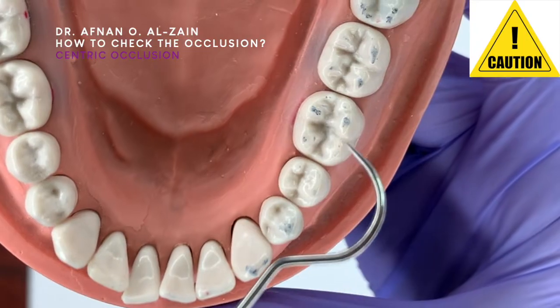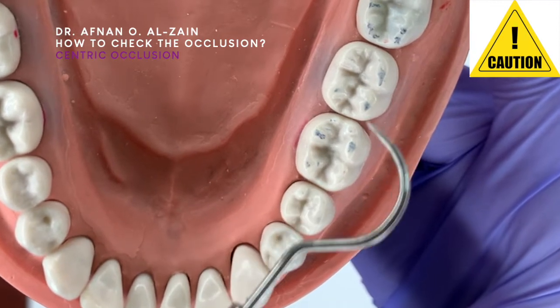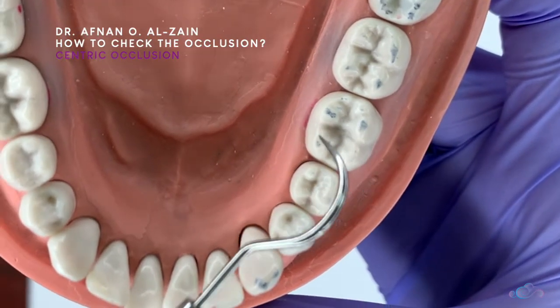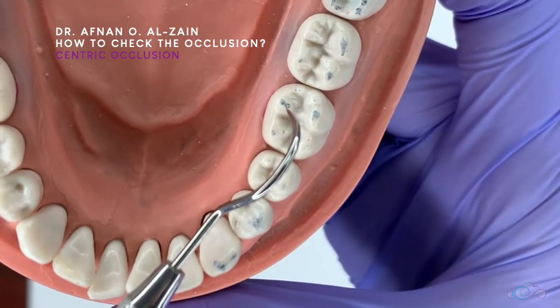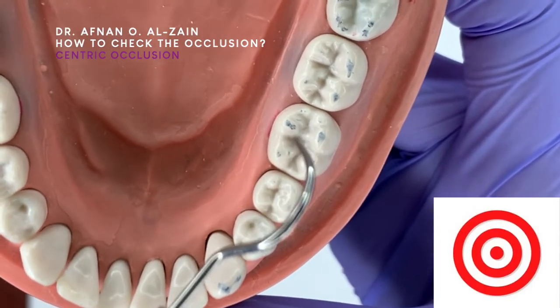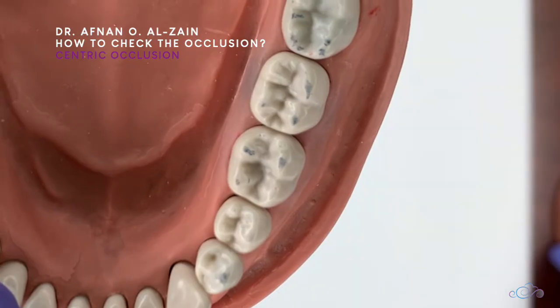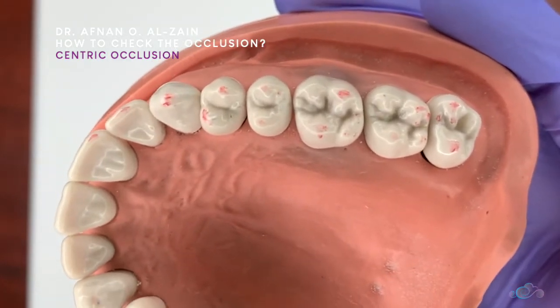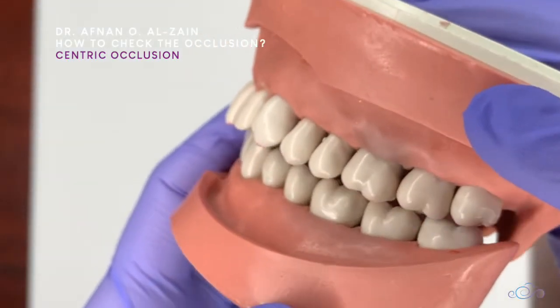Remember that you need to check occlusion prior to starting cavity preparation, so after the restoration you return the occlusion back to normal. If any point is high it will show a dark mark compared to the other teeth. If it is very high, there will be a dark circle with a tear in the middle — this is called a bull's eye. These markings appear on the lower jaw, and similar markings are visible on the upper jaw where there is tooth contact.